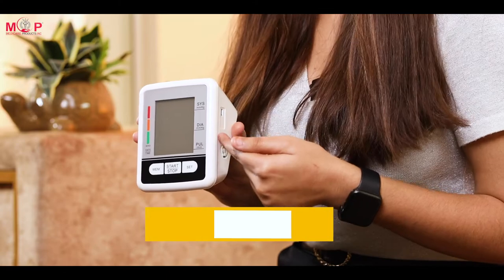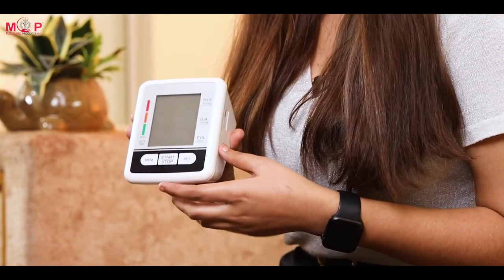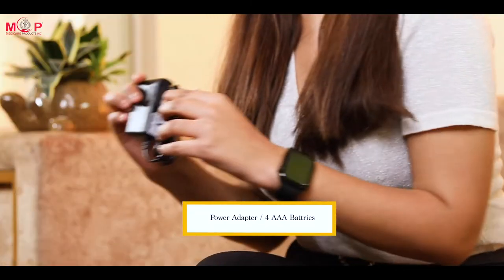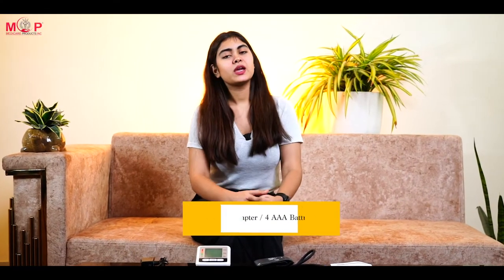It has a large LCD screen with extra large buttons, which makes it easy and comfortable to use. The time and date are displayed on the bottom of the screen. The systolic blood pressure, diastolic blood pressure, and pulse rate are all displayed on the screen separately.